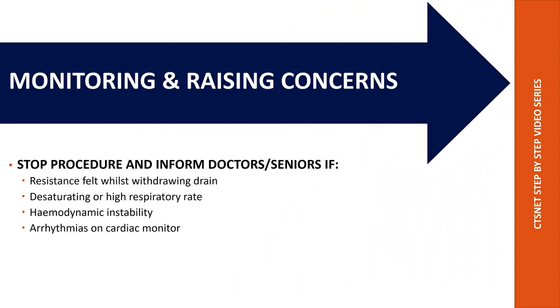Stop the procedure and inform doctors if you feel resistance whilst withdrawing the drain, if the patient desaturates or has a high respiratory rate, if they become hemodynamically unstable, or if you see arrhythmias on the cardiac monitor.